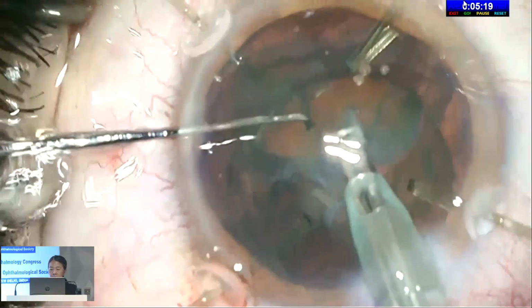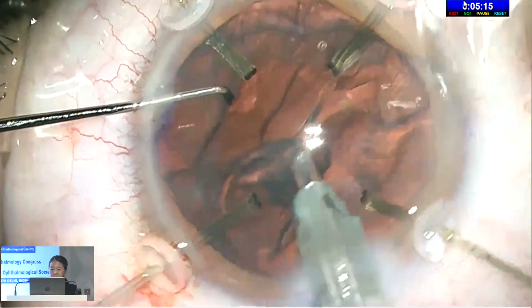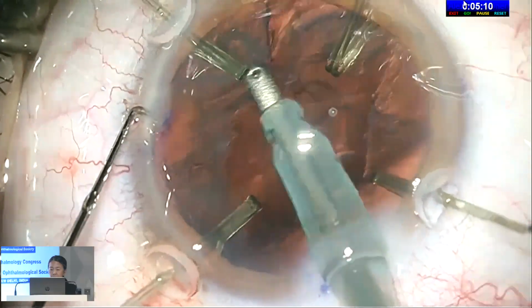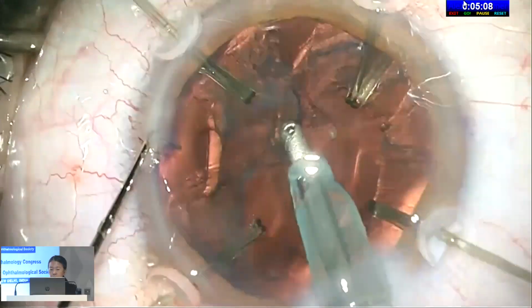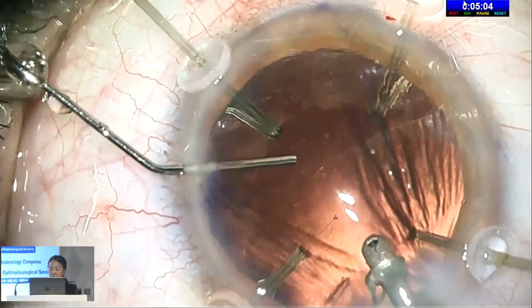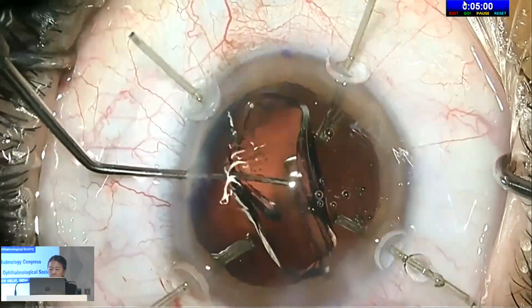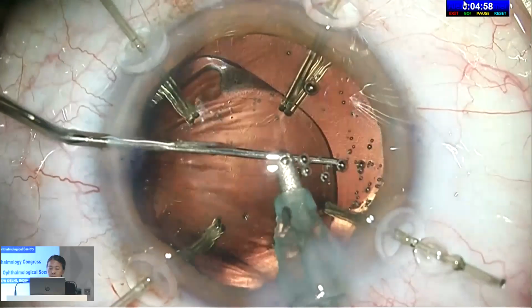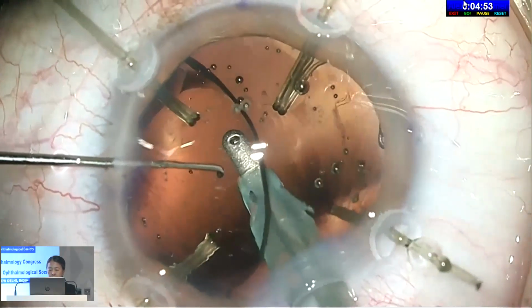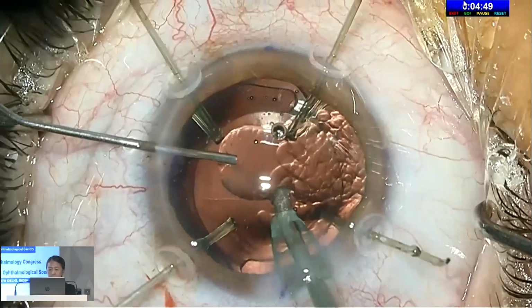You can rotate it safely without embarrassing any of the zonules that are still remaining, and you'll see that when I remove the cortex, some may be trapped, but usually the trap is very little if you're very meticulous in the plane in which you dissect it. And you can see here really no trapped cortex. All right, so it's not difficult, and it's important to put the CTR in early in these cases of very severe subluxation. All right, because that actually pushes the equator out and keeps the lens in the anatomical position.